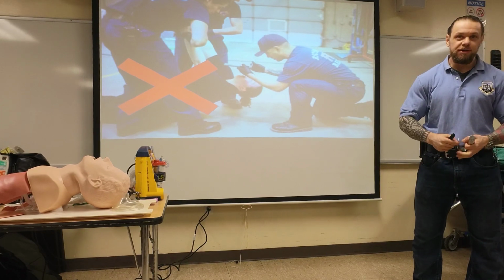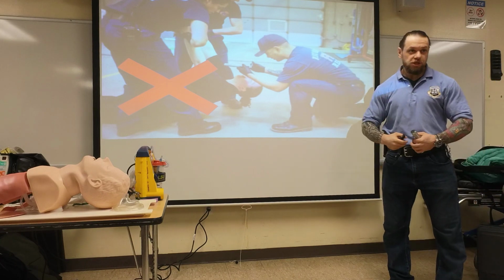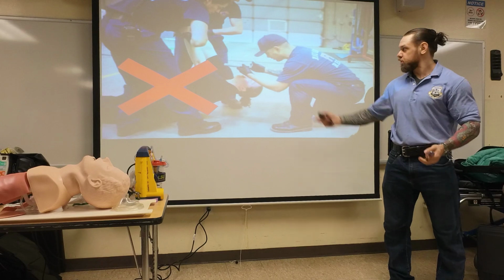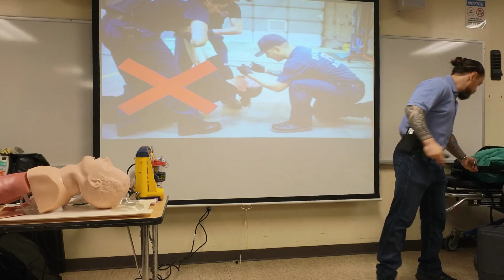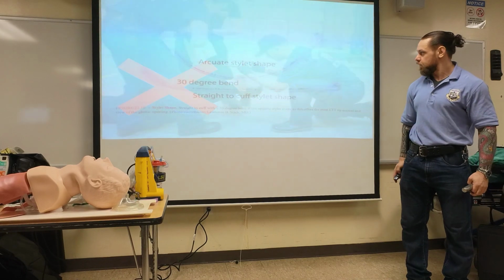You've seen it? The reason is you have a mobile patient. You think these guys are going to keep them stationary? The patient's going to move about, and you're going to move your hand. Don't do this. Put some sheets, put your O2 bag, whatever you've got, put in your fluids. Like this shows. Don't do this.